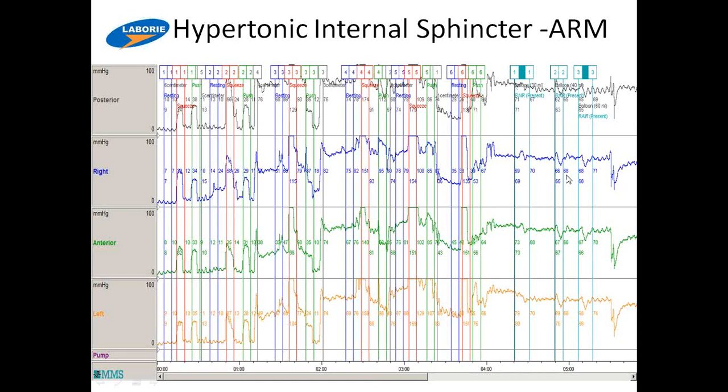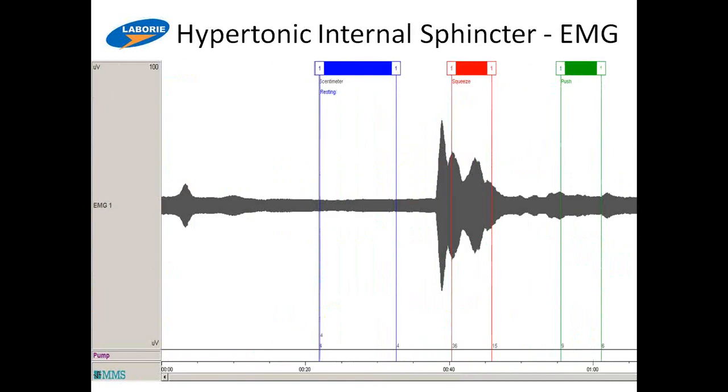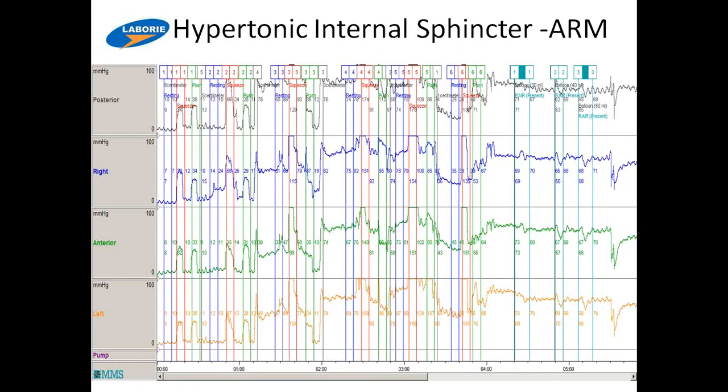I read the RAIR as present. I think this one you can say is present. It's a little small here, but on the tracing it's a little easier to see. And his sensation was a little blunted, but heck, he was 86 years old. And let's see, EMG. Let me just say something about this. The value of the EMG: I do know a lot of places, even a place in Dallas and a place here in Tyler, where the GI people do the anorectal manometry, and they don't have EMG.